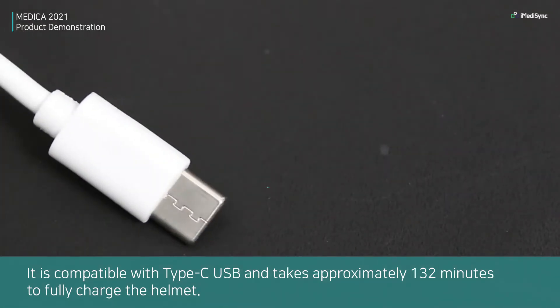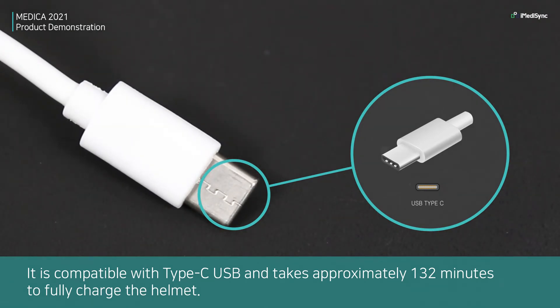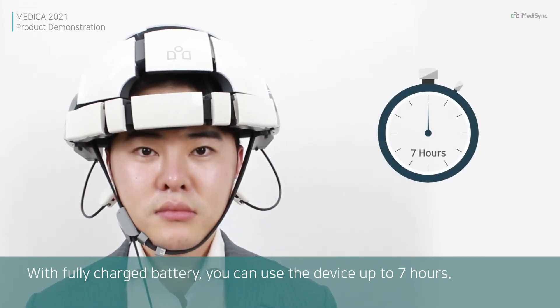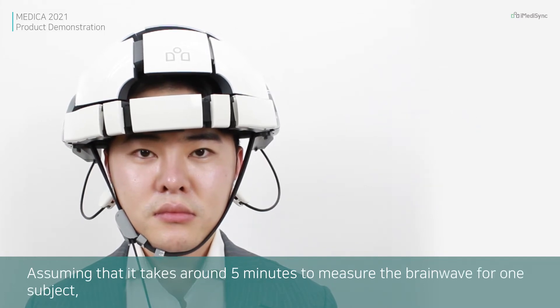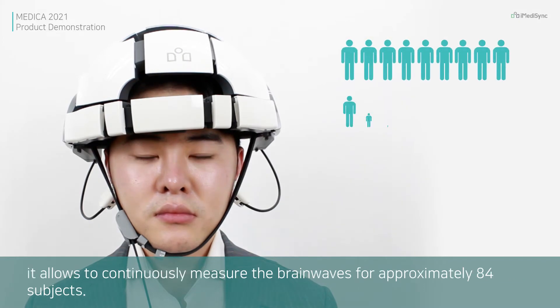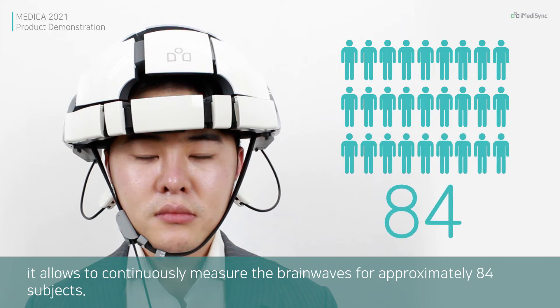It is compatible with Type-C USB and takes approximately 132 minutes to fully charge the helmet. With a fully charged battery, you can use the device up to 7 hours. Assuming it takes around 5 minutes to measure the brainwaves for one subject, it allows continuous measurement for approximately 84 subjects.